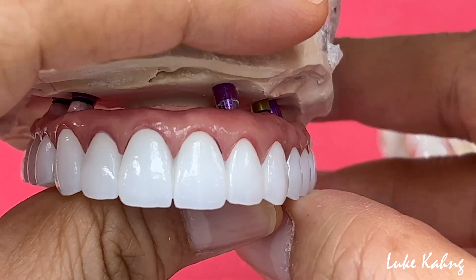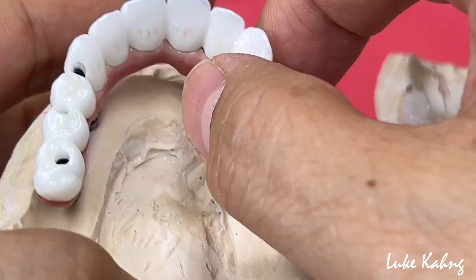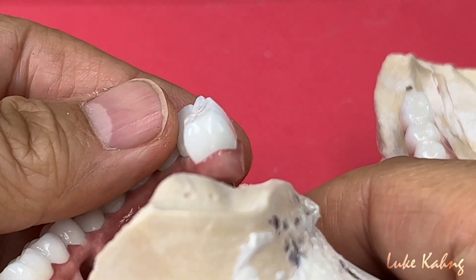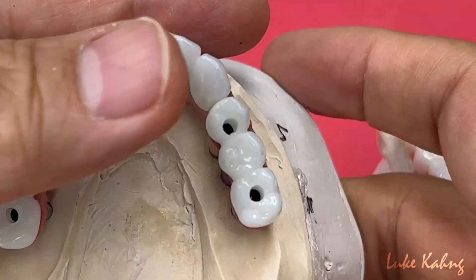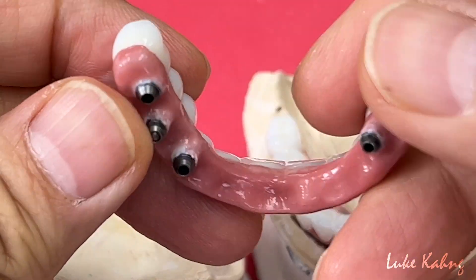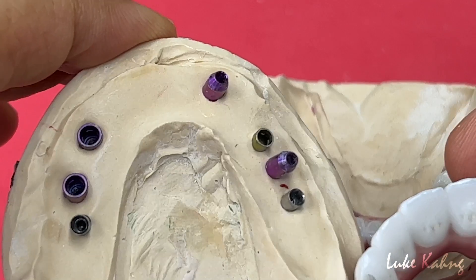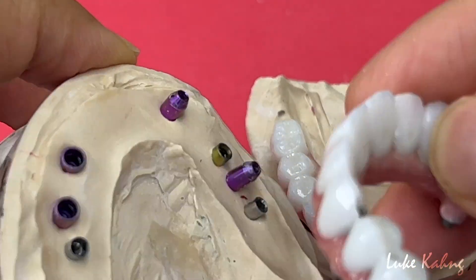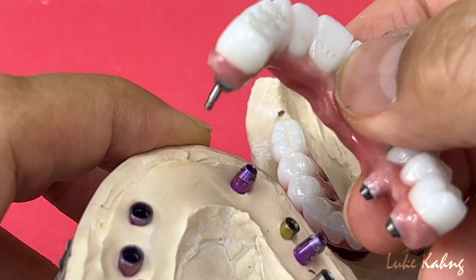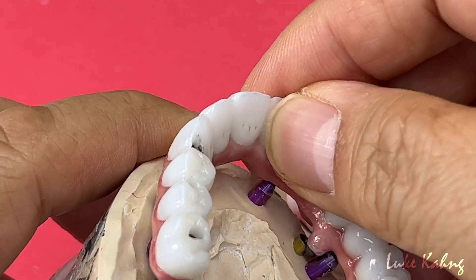This is what it looks like — we overcome the obstacles about the long span, trying to make it as thin as possible. This is really cool. So we finished the five implant case. That's a bicon implant. Implant positions: two, three, one, five.